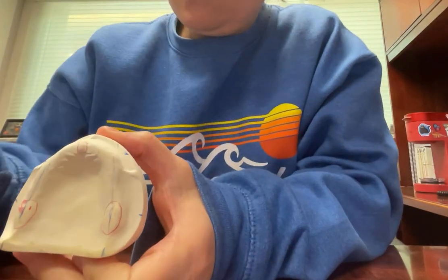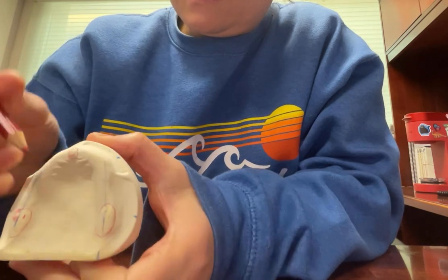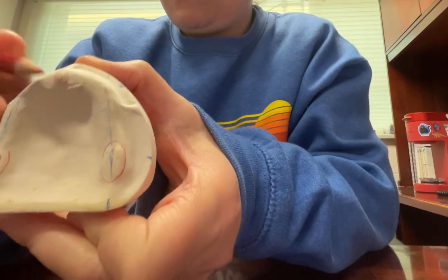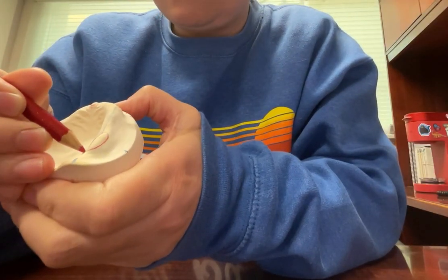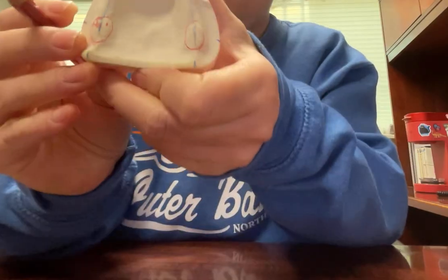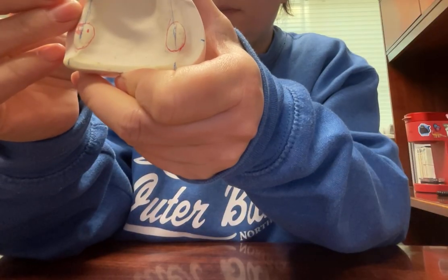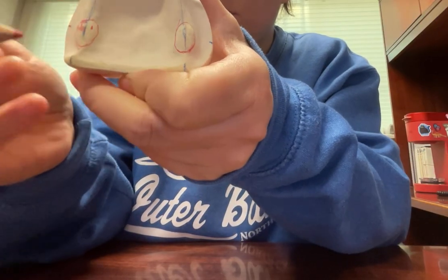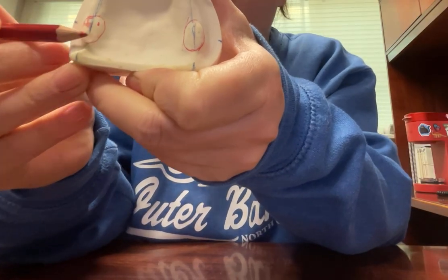So the first thing we do is we're going to circle 3 landmarks. We want to circle the incisive papilla, and we want to circle the tuberosities. So the tuberosities are here and here. The incisive papilla is a reference for where we position our anterior teeth on the denture. The tuberosities are a reference for where we position our posterior teeth on the denture.